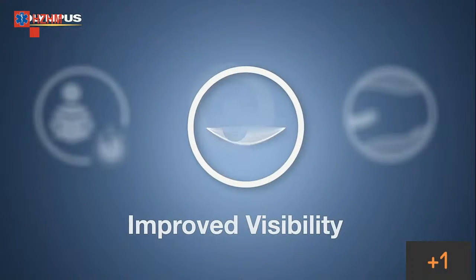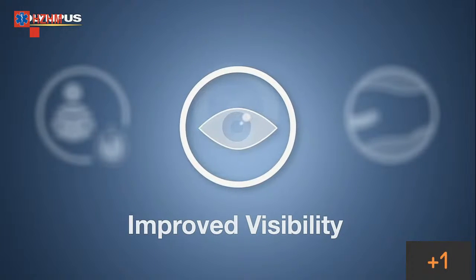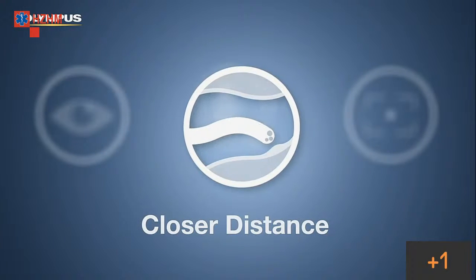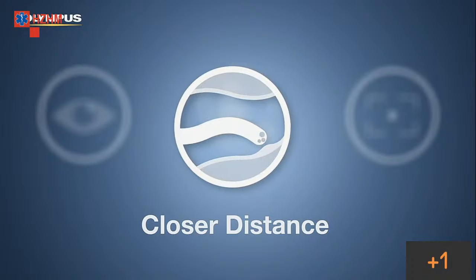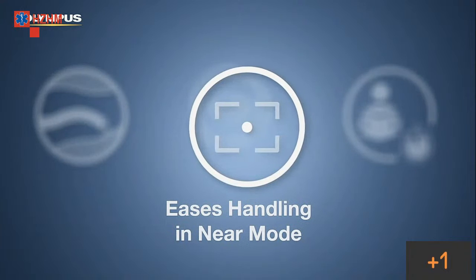EDOF supports the detection of lesions through improved visibility thanks to a broad focus range and less blurring. EDOF allows for a much closer distance to the object in normal mode compared to previous dual-focus endoscopes. Therefore, EDOF was developed to ease handling significantly by reducing the need to frequently switch from normal to near mode. EDOF is designed to also ease handling in near mode.